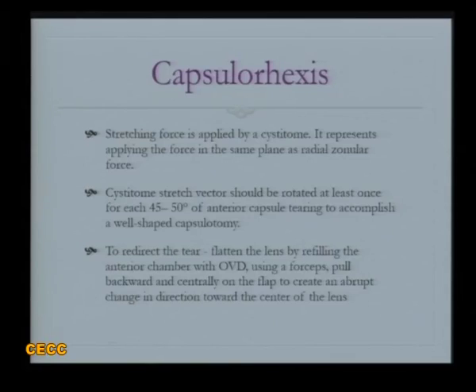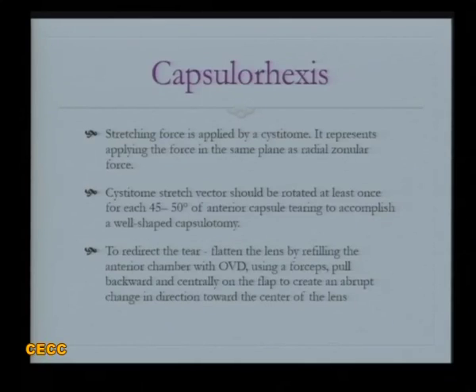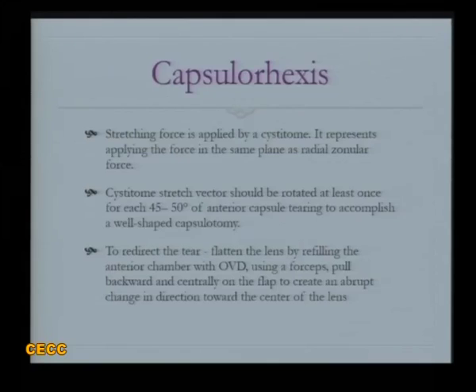It is important that the cystotome stretch vector should be rotated at least every 45 to 50 degrees to accomplish a well-shaped capsulorrhexis. We may have to refill the anterior chamber if we cannot stabilize it, and we use forceps whenever the rhexis has gone outside to bring it back centrally and create an abrupt change in the direction of the anterior capsule.